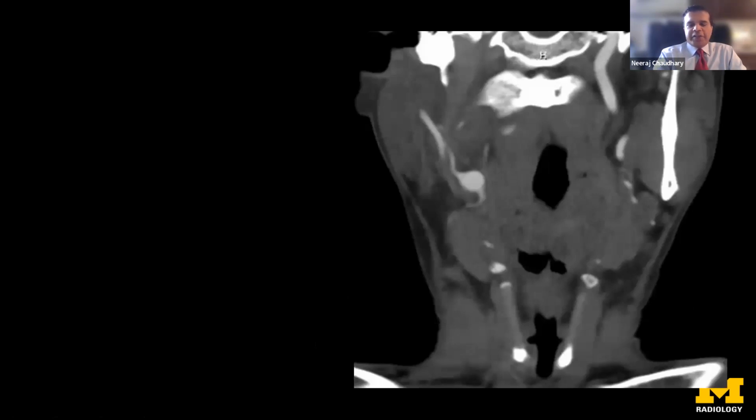So we see the dissection on CT angiogram, and after a lot of discussion with stroke neurologists, the emergency department physicians and the patient, we decided to go ahead with treatment because his hand function is very, very important to him from the point of view of his profession.